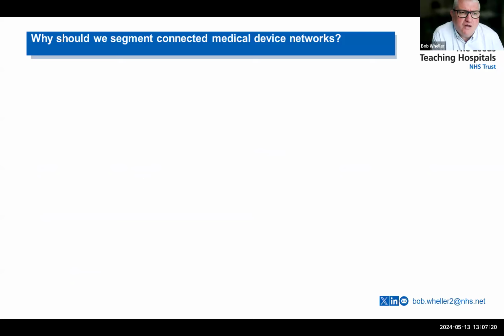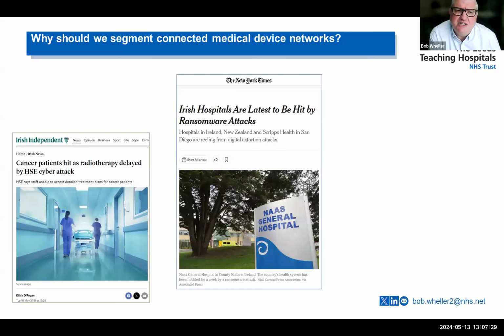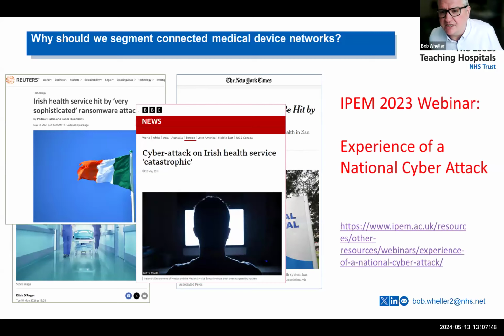So why should we segment our connected medical device networks? Well, in last year's webinar, we did a presentation about the Irish health service network that was affected by a cyber attack, and it closed down services across the whole country for some days. Certainly the radiotherapy service was closed for 6 days.